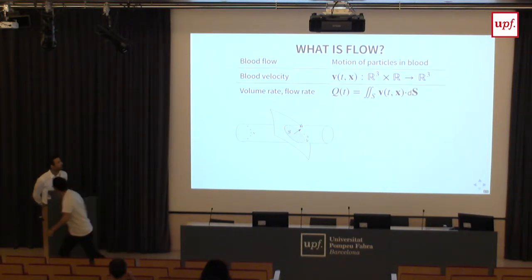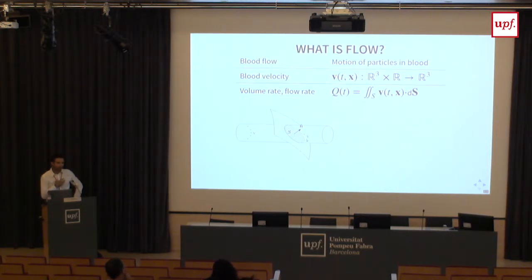All right. So flow rate is a global quantity over time, a scalar value over time. And it's calculated as the amount of flow, or the velocity of this flow that goes through a surface. And something that is very important, and we will come back to this in a second, is that when you calculate this, this measurement should be independent of what surface you choose. So in this case, you have this surface, but it could be any other tilted surface. The only thing that matters is if you define a vector perpendicular to the surface, the only component of the velocity that influences or contributes to flow rate is the component parallel to this vector n. So velocity has three components, but you only need one to calculate flow rate. And we will see later on why this is important.